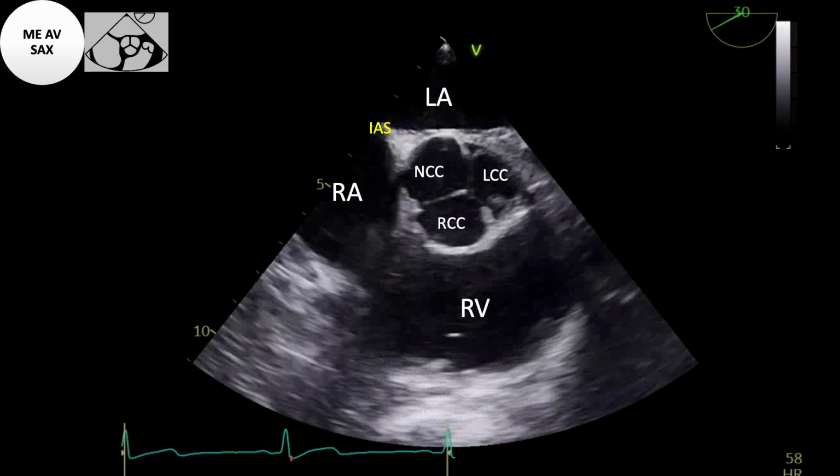As mentioned before, at the mid-esophageal level, the ultrasound beam passes through the left atrium and is aligned parallel to the AV annulus. The 3 aortic cusps should appear symmetrical. The non-coronary cusp is adjacent to the interatrial septum. The right coronary cusp is most anterior, next to the right ventricle. The left coronary cusp is adjacent to the left atrium. This view is particularly useful for assessing aortic valve disease, the interatrial septum, and the left and right atrium.